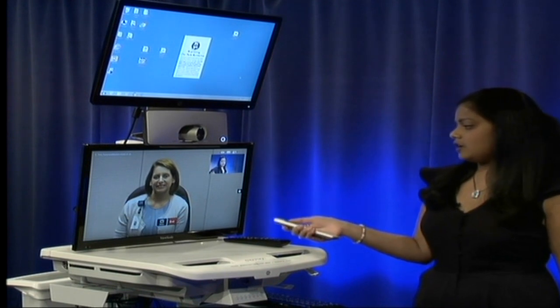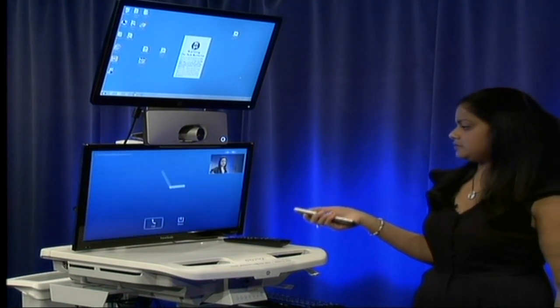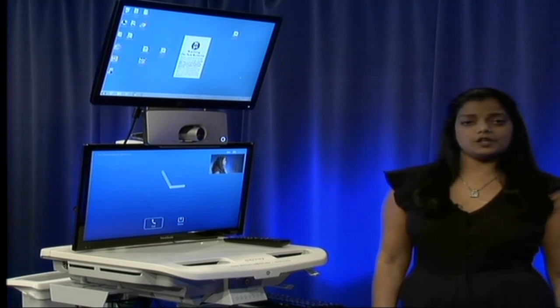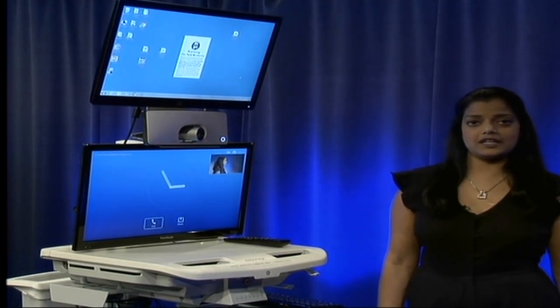And now we will end our call. And that is how you make a video conferencing call using your telehealth cart.